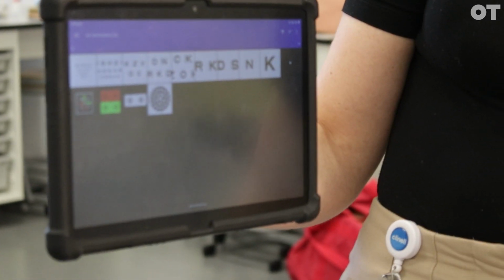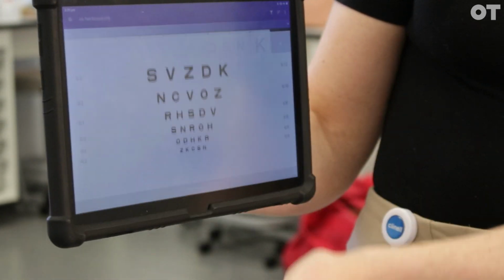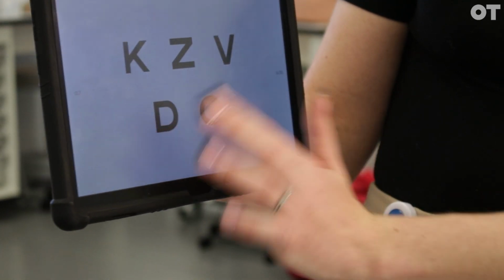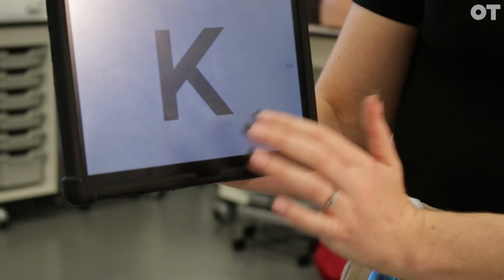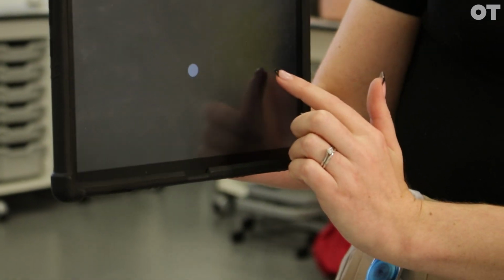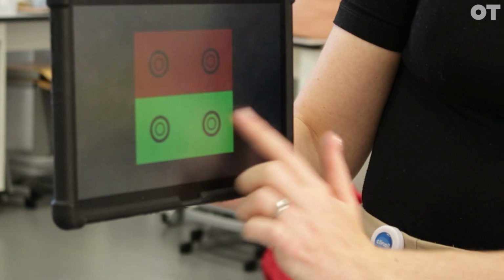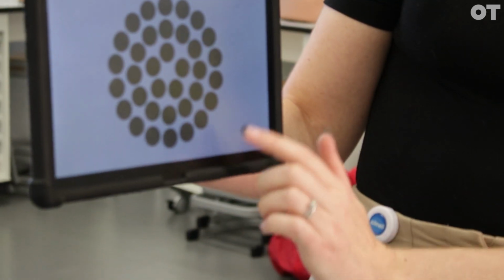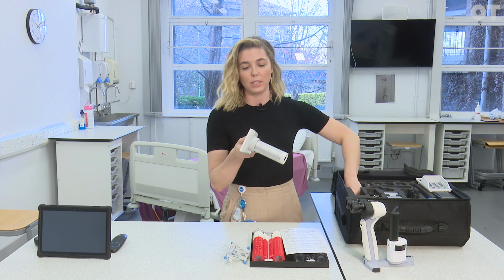We've loads of different settings on the tablet for what we can use as targets, but obviously the most commonly used one is going to be a basic Snellen chart. We've got different sizes we can scroll through. Again, that can be controlled by the remote. We've also got a normal fixation spot, just a target, fixation disparity, duochrome, and then cross-cyl targets on there as well.